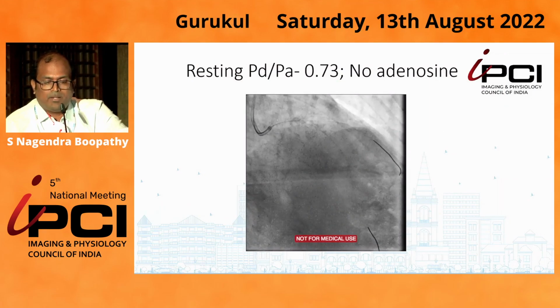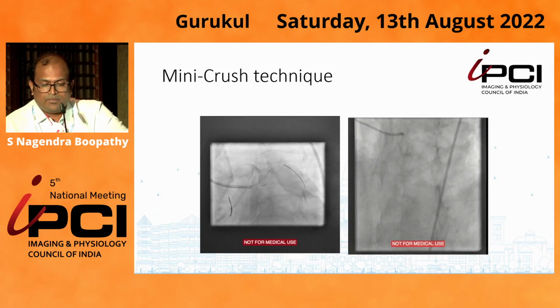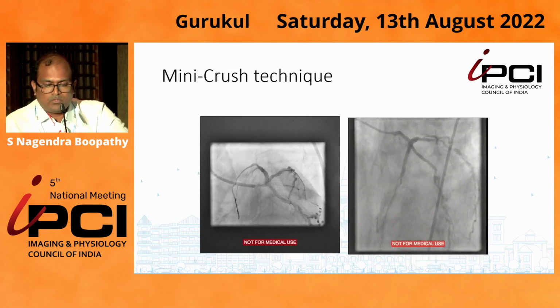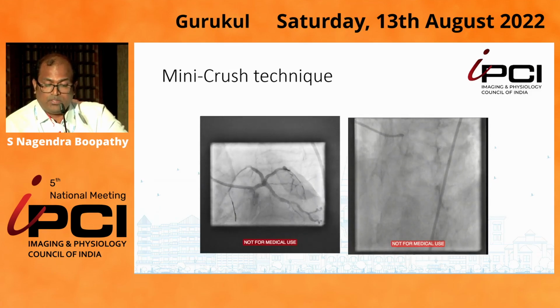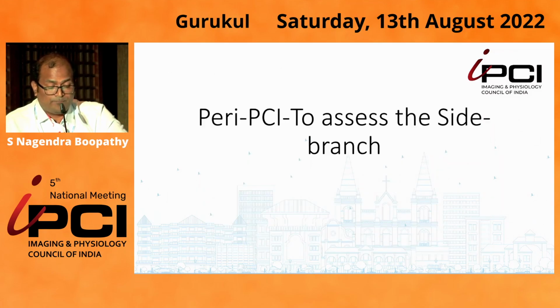We proceeded with a bifurcation strategy PCI. It was a complex bifurcation, DEFINITION strategy. We did a mini crush. He was doing fine 5 years after the procedure. In the last COVID pandemic, the second COVID pandemic, we lost the patient because of COVID.